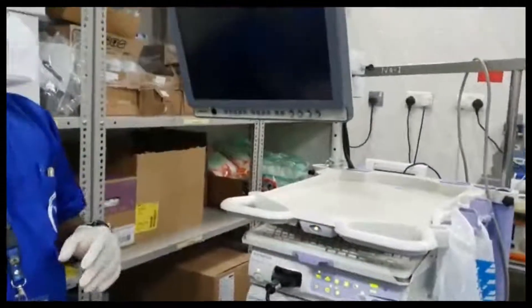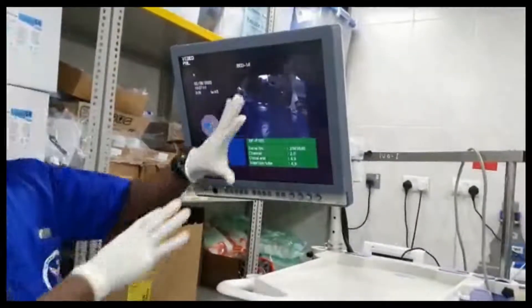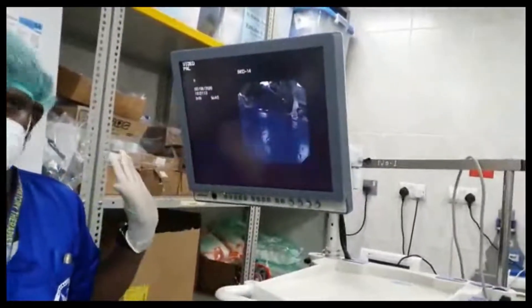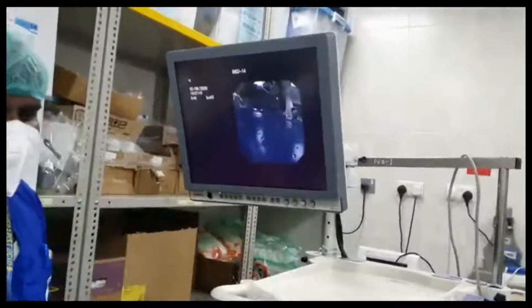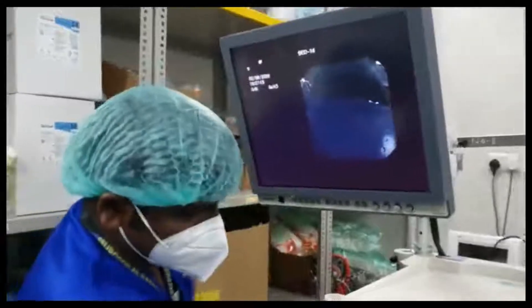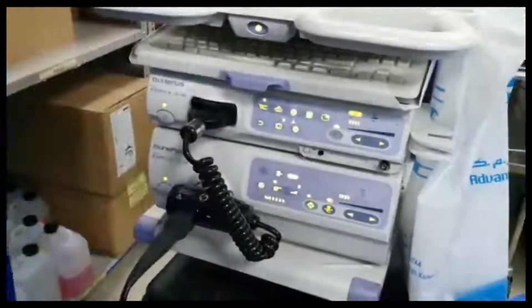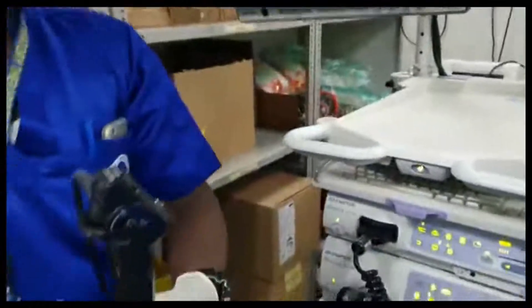First, press this button, then the second, third, and fourth button. The image will come on the screen — see, it's appeared now. Vision is on. I still haven't switched on the light source, so press this light source button and the light is coming. You can see the light is on and the scope is working.